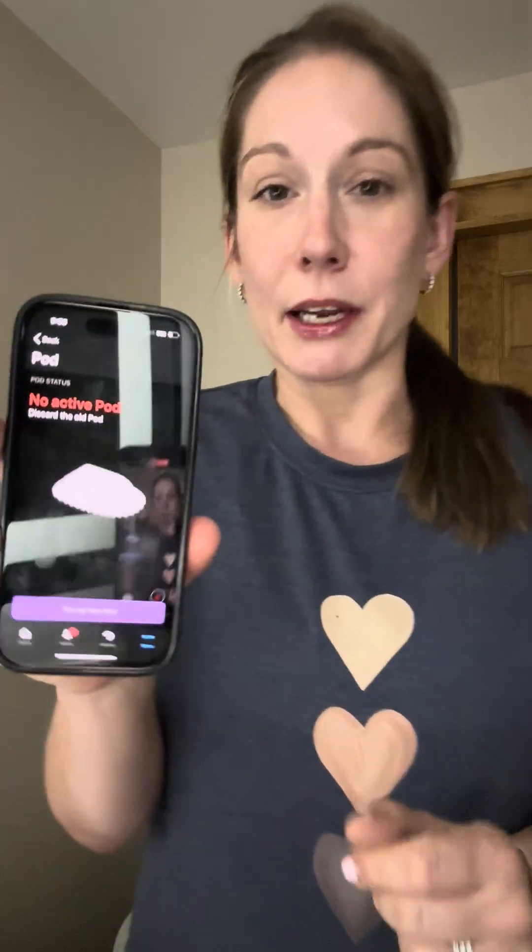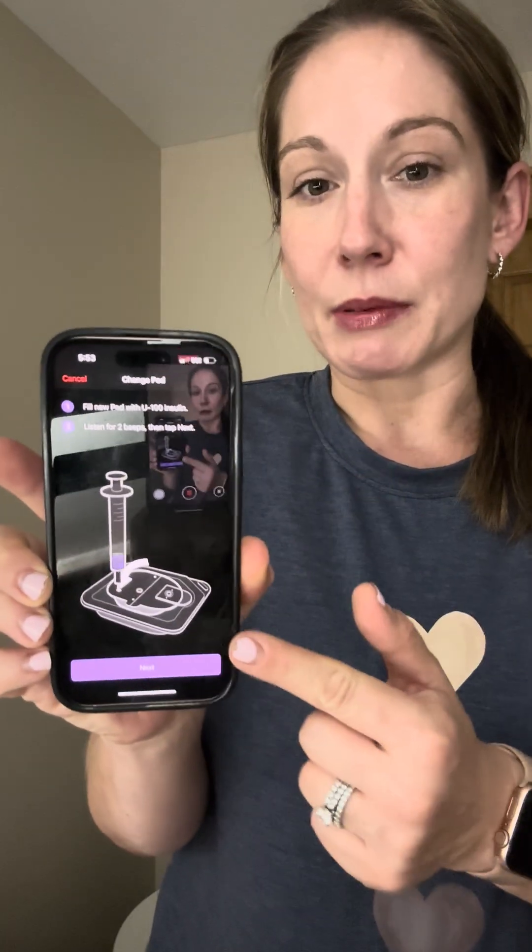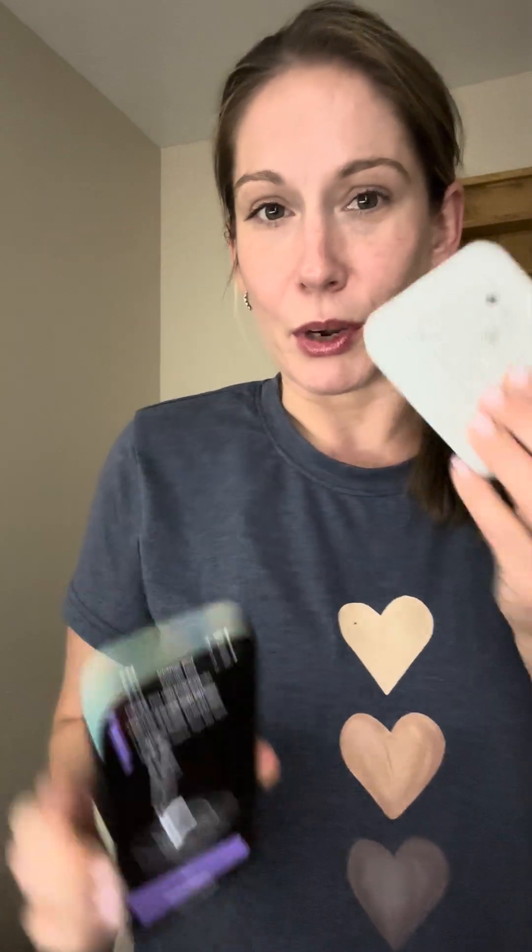Before even messing with Dexcom, I'm going to set up a new pod. Once you deactivate a pod it's going to prompt you to set up a new one. Now it's going to prompt me to fill up my pod with insulin. I'm going to open this up — as a disclaimer, I'm putting it on my left arm and I've already wiped it down with alcohol. Make sure that you put your pod and your sensor on a clean area so you don't have to worry about infection.